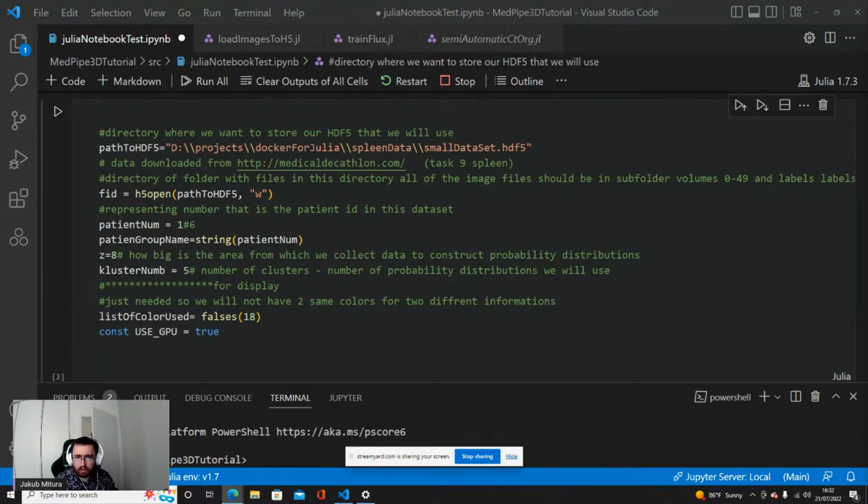Oh, you mean radiotherapy? Basically, there is nothing that would work against it. The most important thing about this framework is that it's not closed. I just gave some visualization data, some helper functions to save the data and load it, but frankly, you can do it.